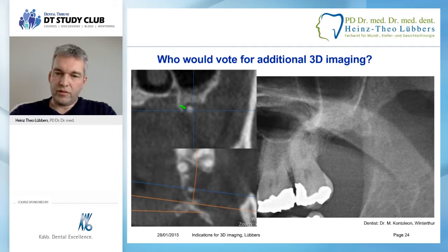foreign body, probably root. I mean, the statistics say it's root, and it's clearly an infectious formation there. Maybe a cyst, maybe just infectious tissue. But now you found a correlation, which we talked about before. You found a correlation to the pain the patient has, and then finally you can treat it.